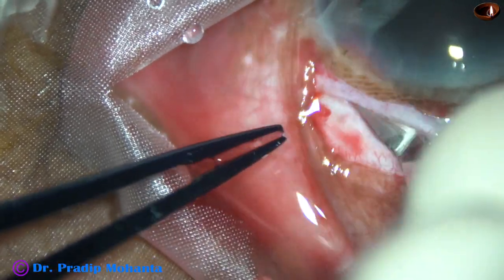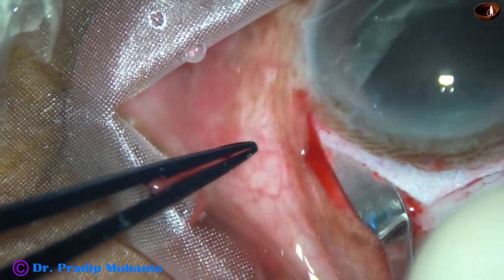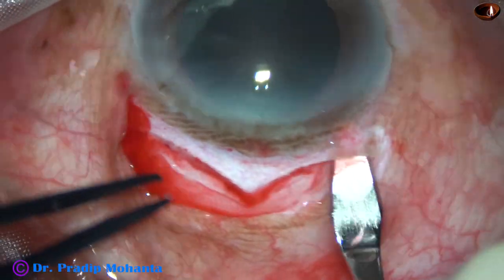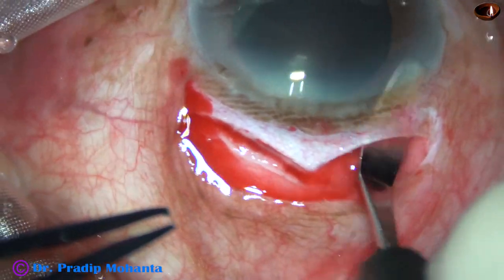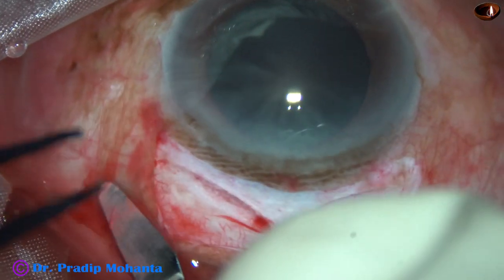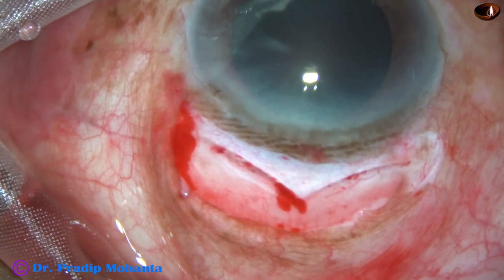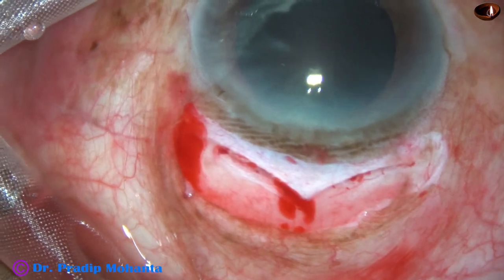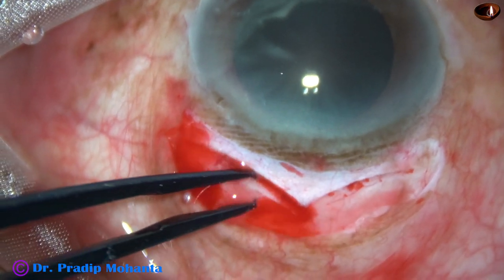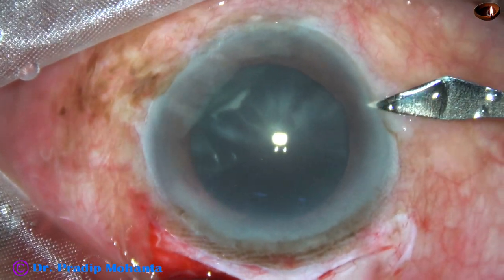This is a large wound of about 10.5 millimeters and the delivery of the nucleus will be very smooth. There are other options — we can divide the nucleus into two halves by snare — but a lot of manipulations are required and there is a possibility of endothelial cell damage in the hands of those who do not use snare regularly.